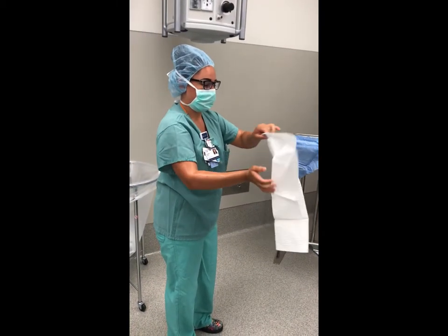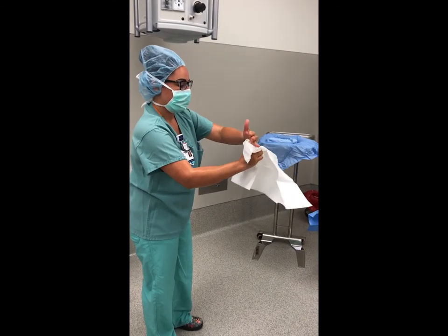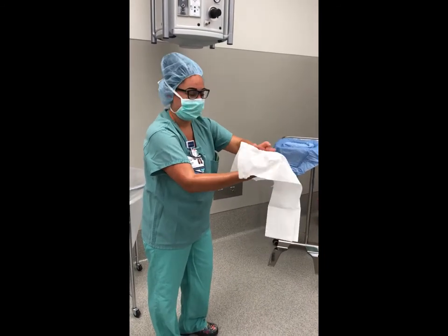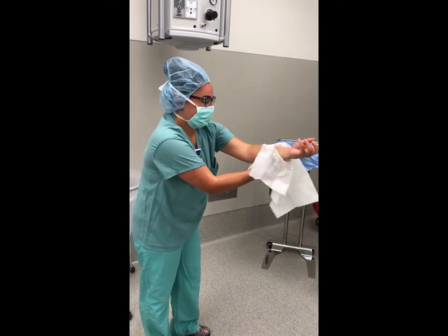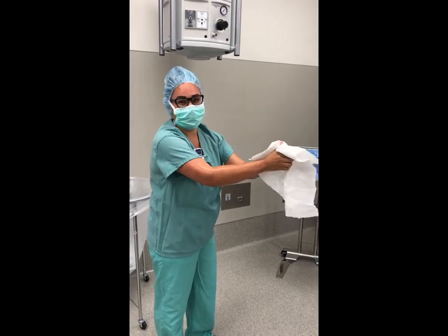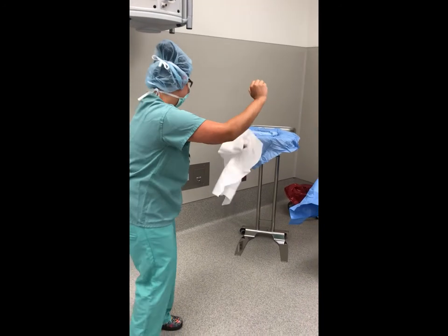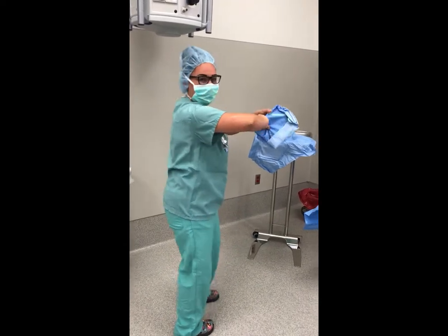If the towel contacts an unsterile surface, the towel is considered to be contaminated. The top half of the towel is held securely with one hand, and the opposite fingers and hands are blotted dry, ensuring that they are thoroughly dry before moving to the forearm. Areas are not retraced once they are dried. The lower end of the towel is grasped with the dry hand, and the same procedure is used for drying the second hand and forearm. Care must be taken to prevent contamination of the towel and hands. Once finished, the towel is discarded without dropping the hands below waist level.